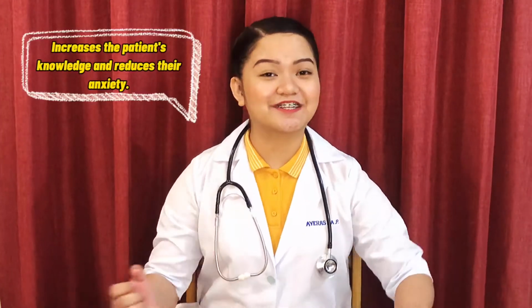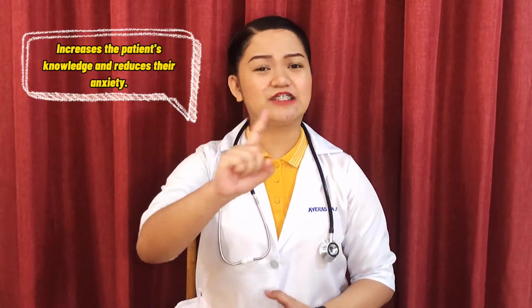Good day, ma'am. Your name, please? Good day, Ma'am Irene. And I am Maria, your nurse for today. So, I will be administering you via intramuscular injection in order to have a faster rate of absorption rather than the subcutaneous injection. So, just simply relax and please cooperate. And if you have any questions, don't hesitate to ask me. Thank you. Explaining rationale increases the patient's knowledge and reduces their anxiety.